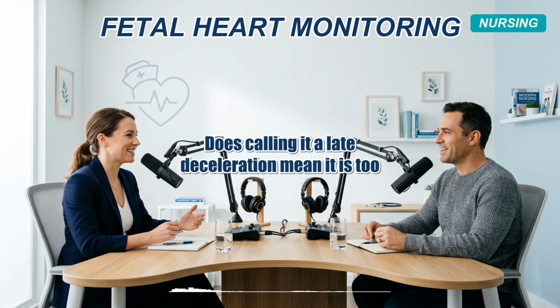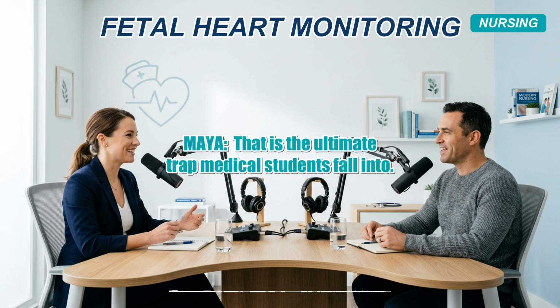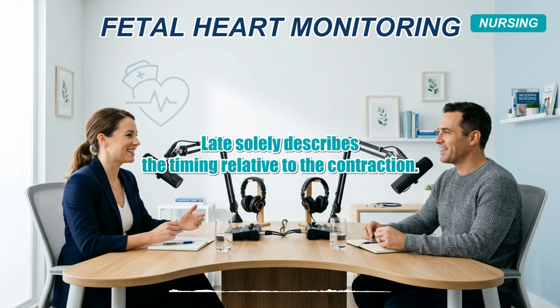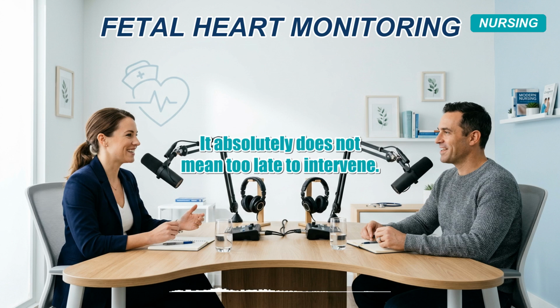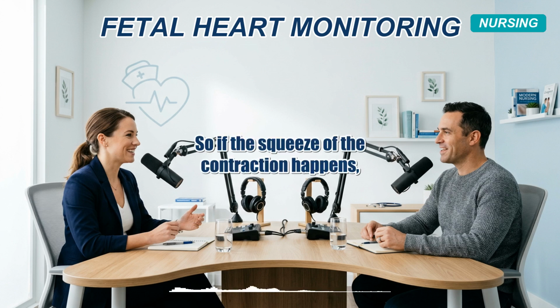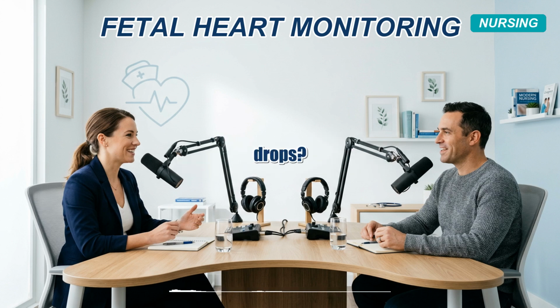I have to ask a question here about the vocabulary. Does calling it a late deceleration mean it is too late to help the baby? Or does it just mean it's more severe? That is the ultimate trap medical students fall into. Late solely describes the timing relative to the contraction. It means the drop is delayed. It absolutely does not mean too late to intervene. Got it. Good to know. So if the squeeze of the contraction happens, why is there a delay before the baby's heart rate drops?